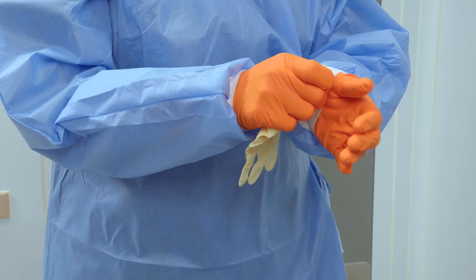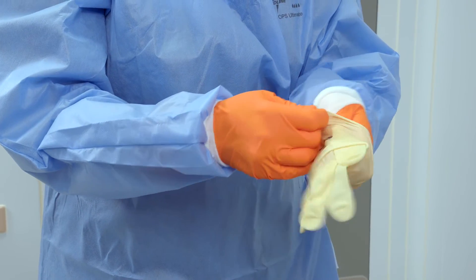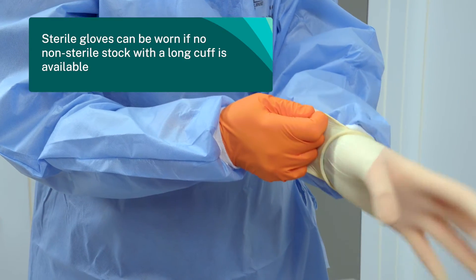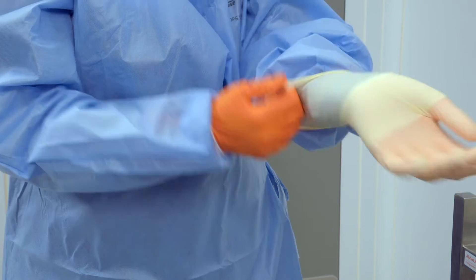The gown's cuff may need to be pulled down to the palm of the hand to ensure adequate coverage. Sterile gloves can be worn if no non-sterile stock with a long cuff is available.